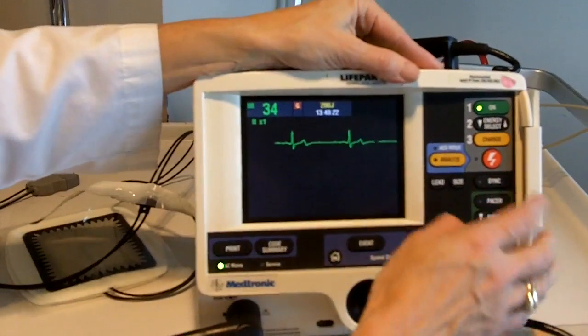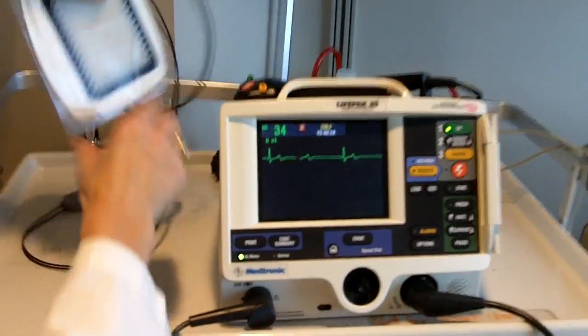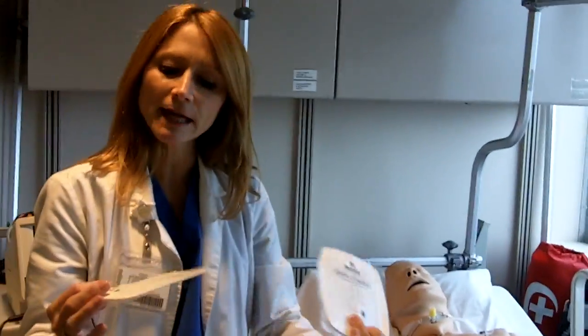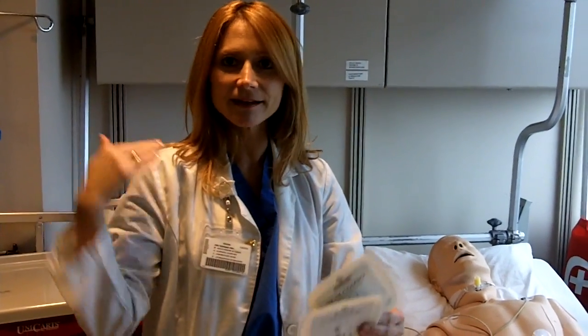I want to now apply my gel pads — my pacing pads — to my patient's chest. I'm going to use the anterior-apex approach. The other approach you can use is anterior-posterior, one on the front and one on the back.